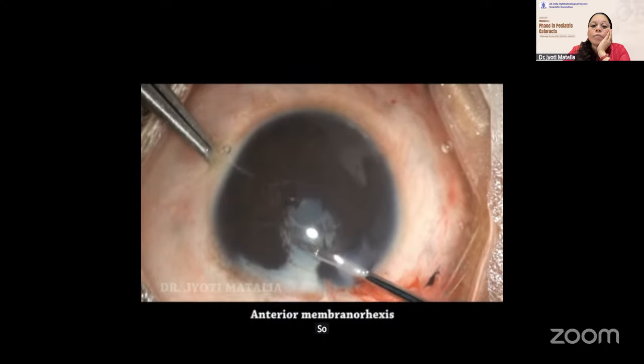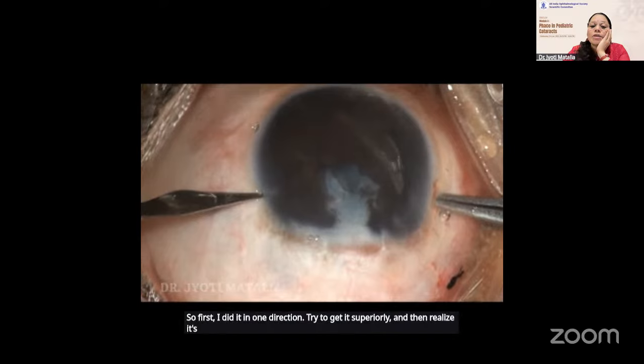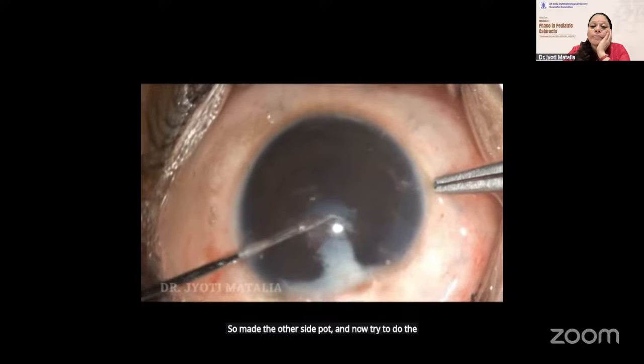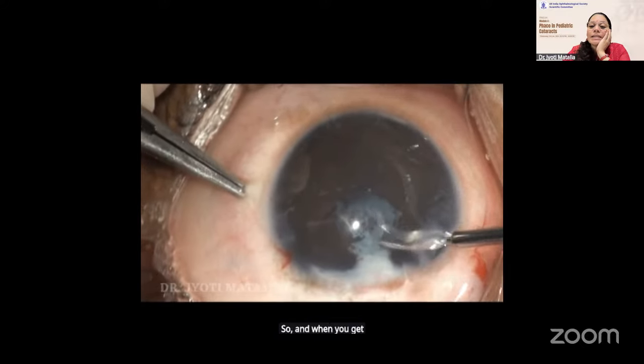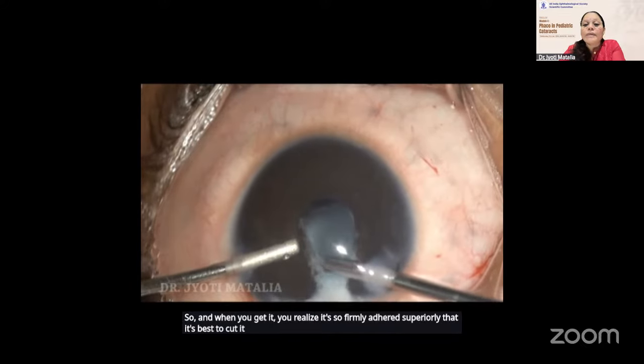So first I did it in one direction, trying to get it superiorly, and then realized it's so adherent. So I made the other side port, and now tried to do the rhexis in the other direction. When you get it, you realize it's so firmly adhered superiorly that it's best to cut it off. So with a vitrector, I have done it.